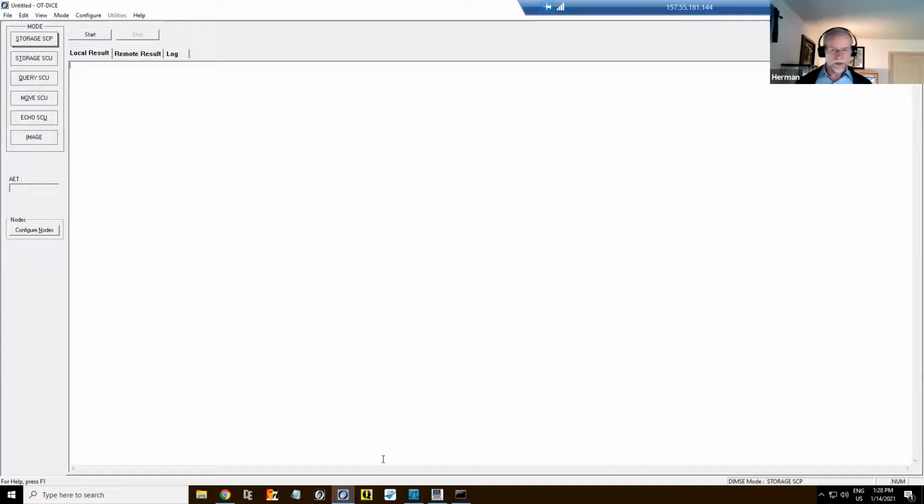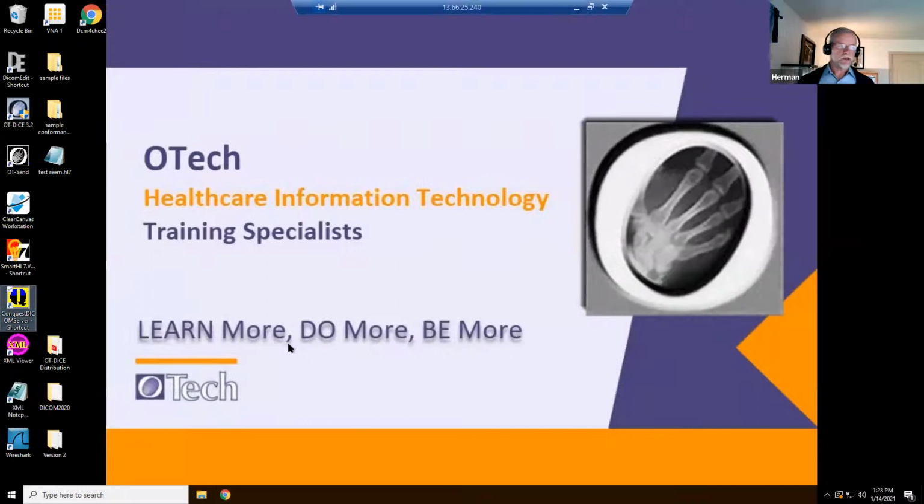I have another virtual machine. Let me just bring up the other virtual machine so that we know what is going on. Here's my other virtual machine. So what we use as the PACS.